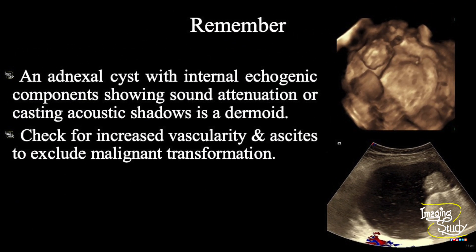The take-home message: an adnexal cyst with internal echogenic components showing sound attenuation or casting acoustic shadows is nothing but a dermoid. Don't forget to check vascularity and ascites to exclude malignant transformation.